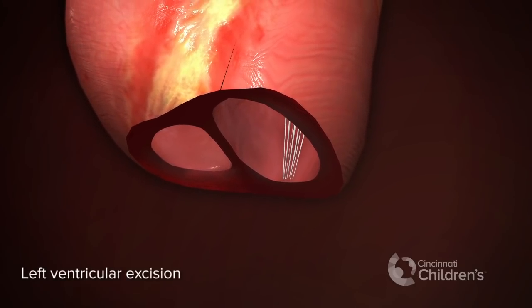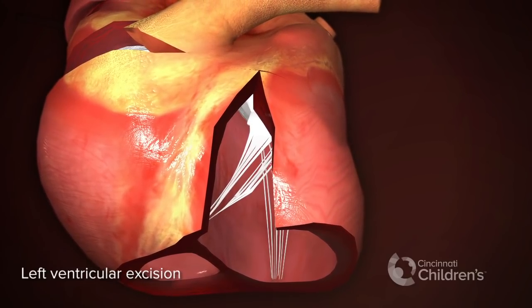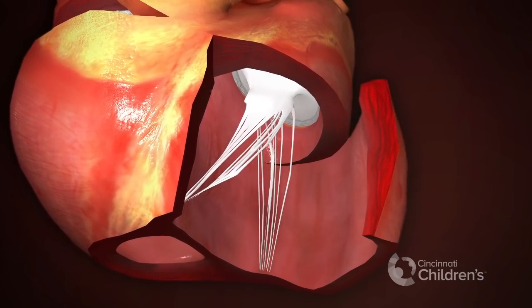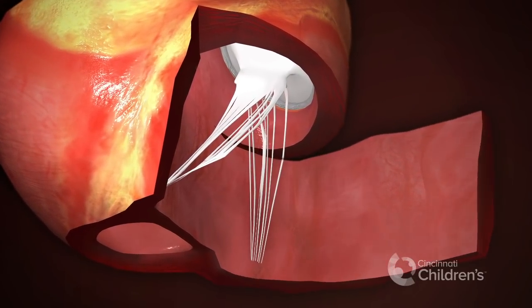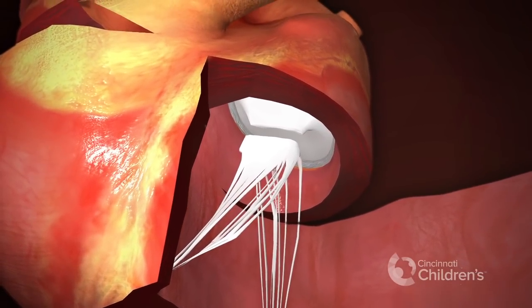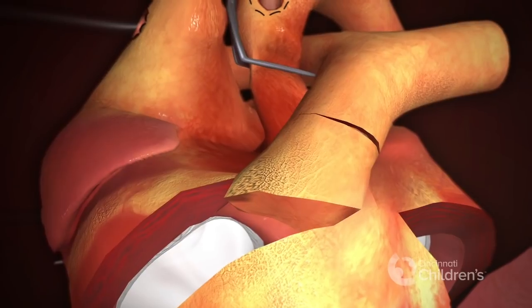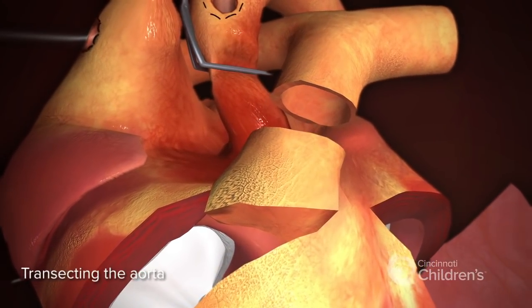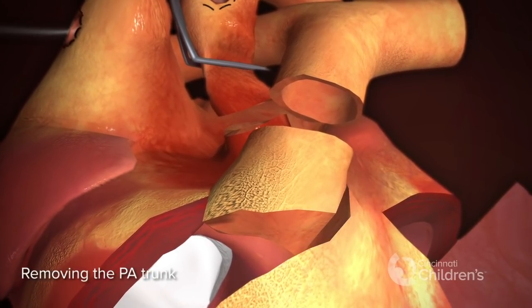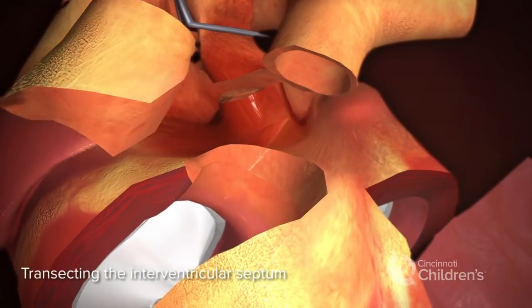Left ventricular excision. Cutting the mitral valve. Transecting the pulmonary artery. Transecting the aorta. Cutting the septum. Removing the pulmonary artery trunk. Transecting the interventricular septum.